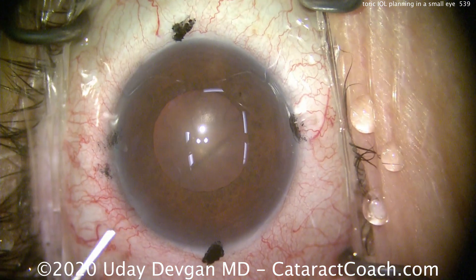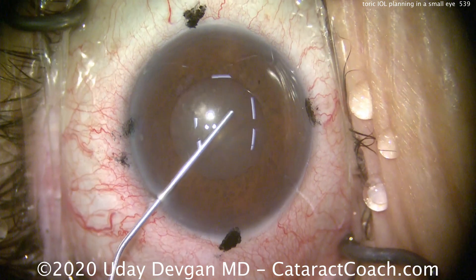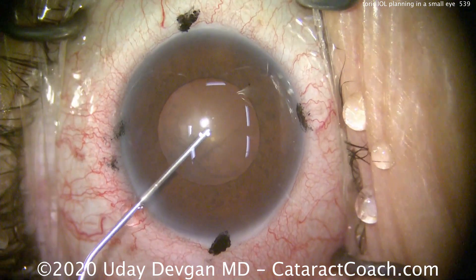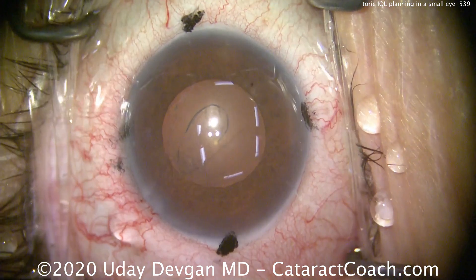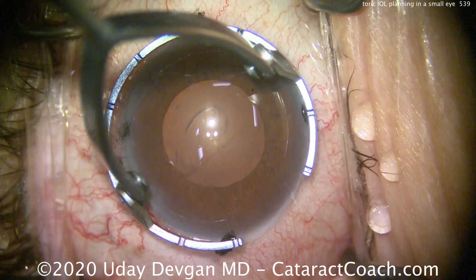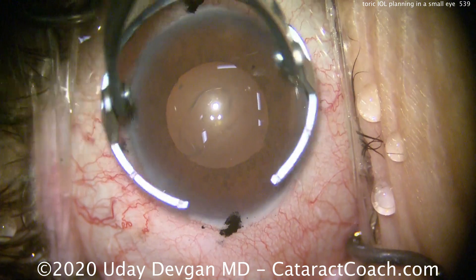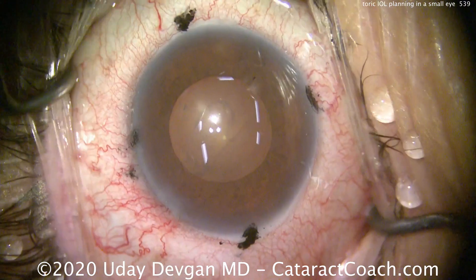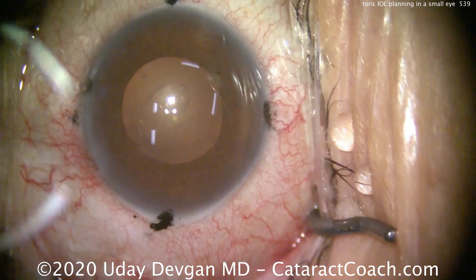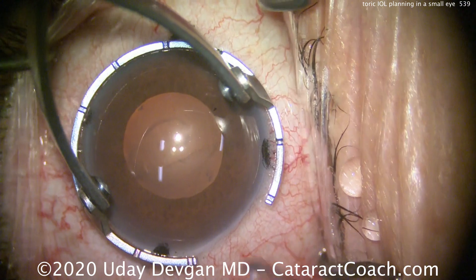We've filled the eye with our anesthetic. Here comes our dispersive viscoelastic. It's a shallow AC — it's very hard for me to come all the way across. This patient is going to get a 29.5 diopter lens; very short axial length. So now we need to make that incision on the steep axis, so we need to rotate the speculum and adjust our microscope as well.